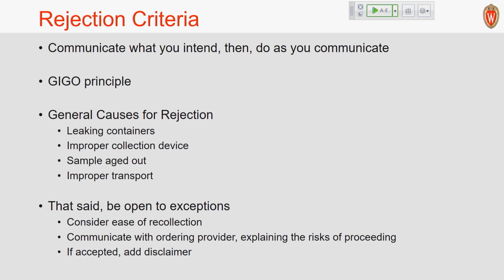If it was a surgically collected tissue and they put it in a non-sterile container, for instance, then the manager or the lab director, or even a tech who's comfortable on the phone, can say, here's the situation, it wasn't collected right, your call. Do you want us to culture it? You might do it, but put in a comment saying this was a compromised specimen, results may be compromised.